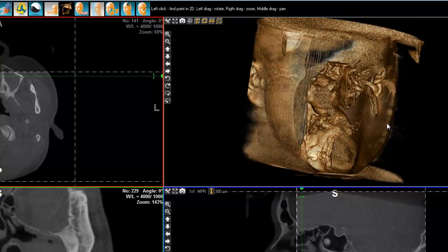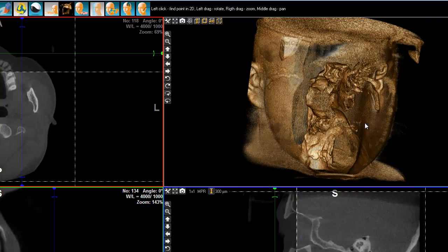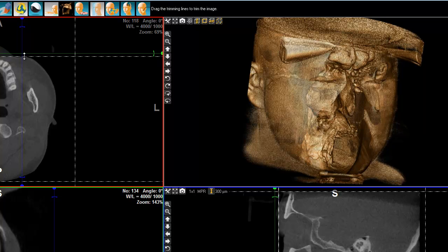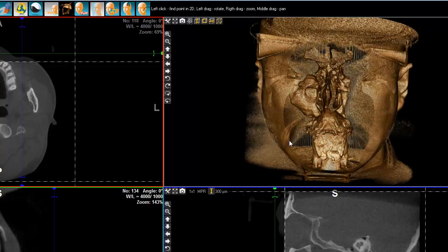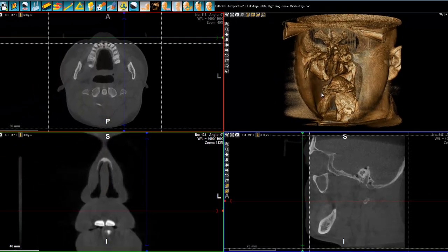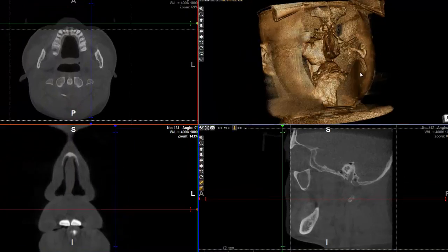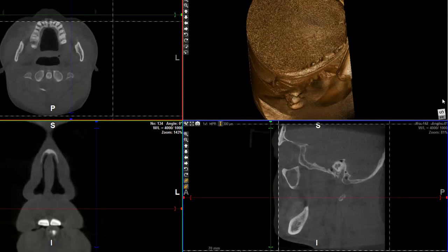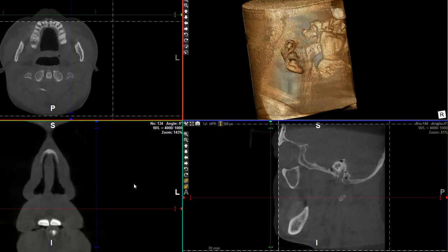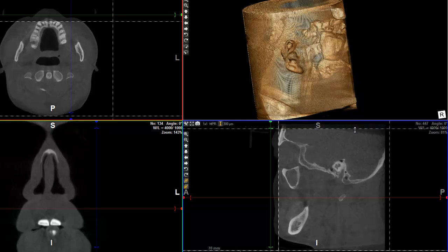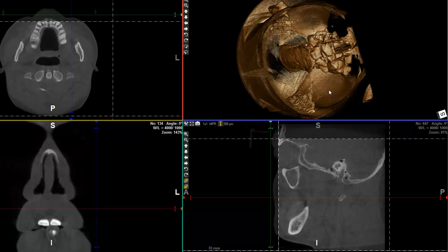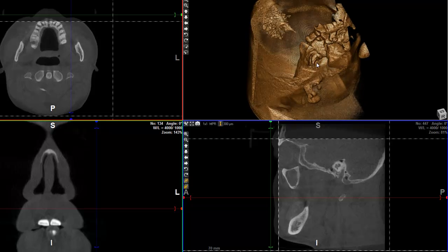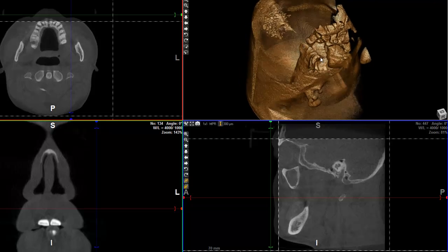Here you see what the airways of the patient look like — it's a sort of inverse, as if the air would be solid. It also gives you a pretty good idea of the anatomy of your patient. Looking from the top, you see all the airways in a very nice and detailed way.